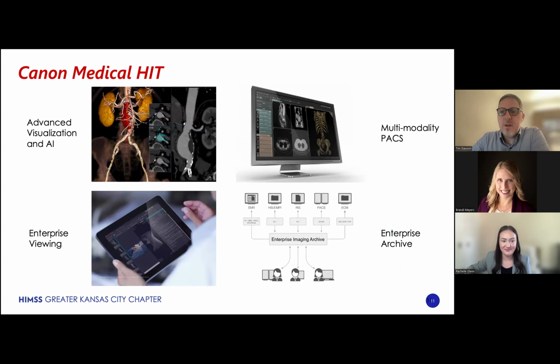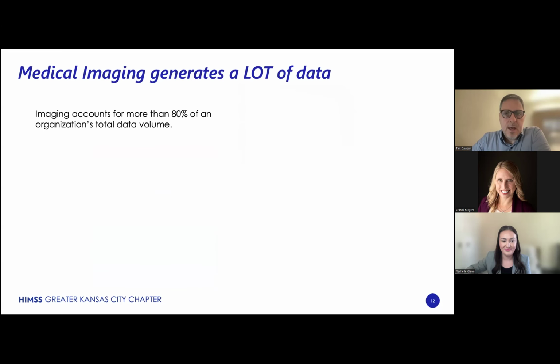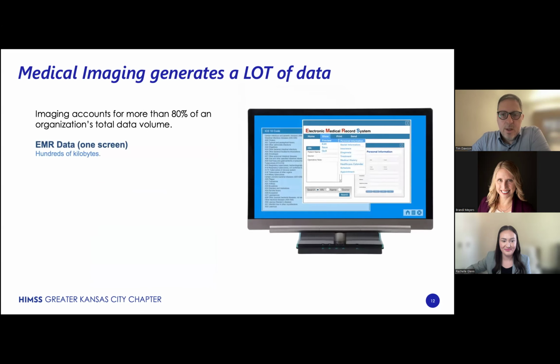With this background, one thing that I know is that these scanners and related tools generate a lot of data. Imaging accounts for the vast majority of your overall data volume. For larger institutions, this is a petabyte scale problem with archives stretching back 5, 8, 10 years or more. So for comparison, the data that populates a single screen from an EMR is typically measured in kilobytes, while medical images themselves are much larger.